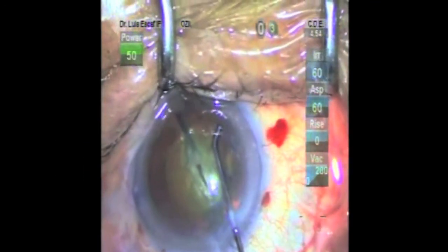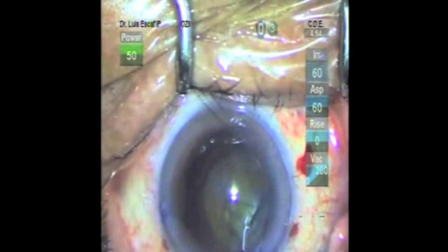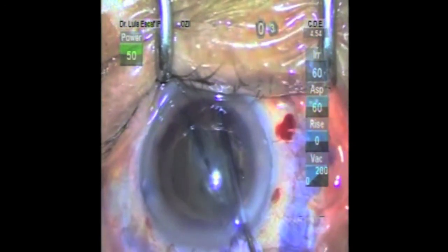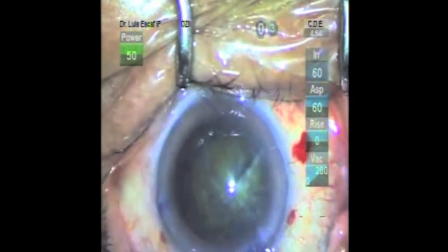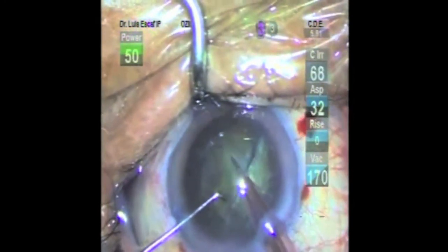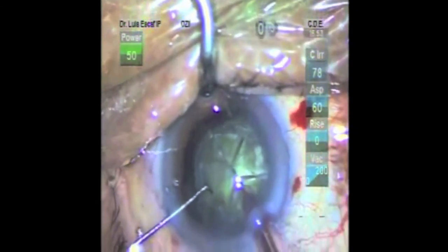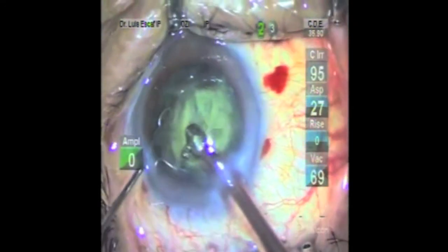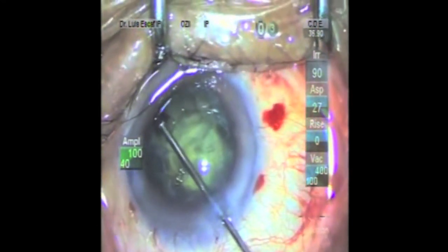In this hard posterior polar cataract 4+, we perform the capsulorexis. Then we make a deep groove with the ultra-chopper and divide the cataract into two halves, preserving the posterior plate. We proceed to hydrodissection, spinning and division of the nucleus into six fragments with the ultra-chopper. We emulsify the quadrants, reducing the thickness of the cataract, and make a small pit in the center to facilitate the fracture.